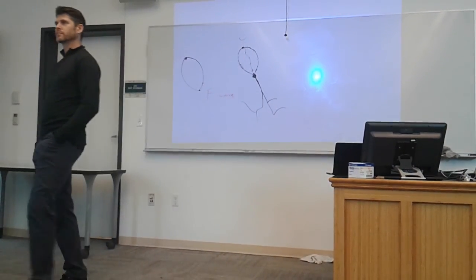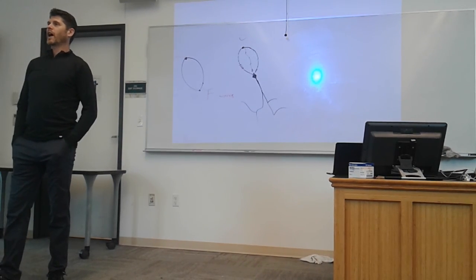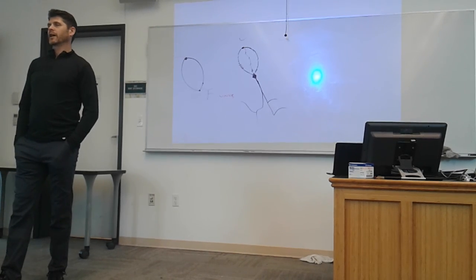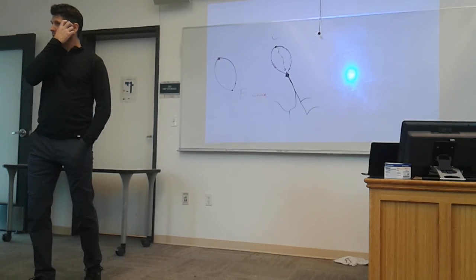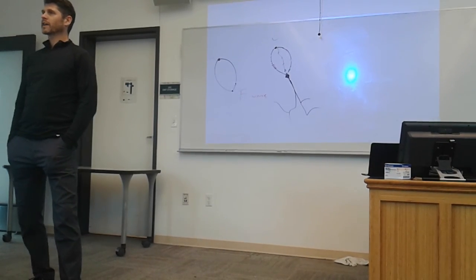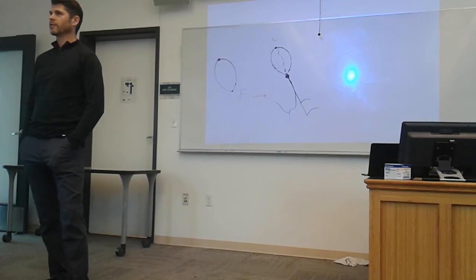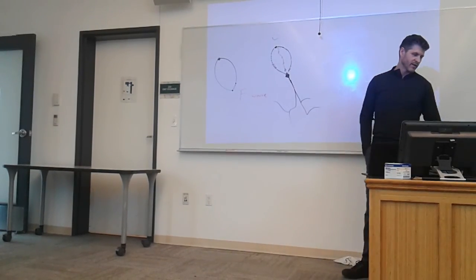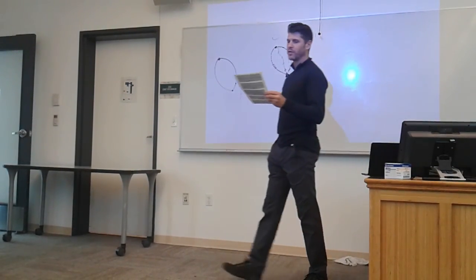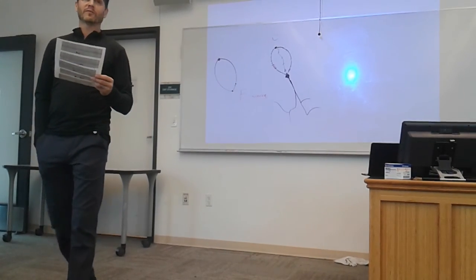And you also want us to identify the atrial rate and the ventricular rate too? Yes, this is the time. I won't be asking you for the atrial rate in a flutter, but this is the appropriate time to start recognizing that the atria and the ventricles sometimes fire separately, with separate rates. You'll note the atrial rate is right about 300 on all of those. It's typically somewhere between 200 and 400.